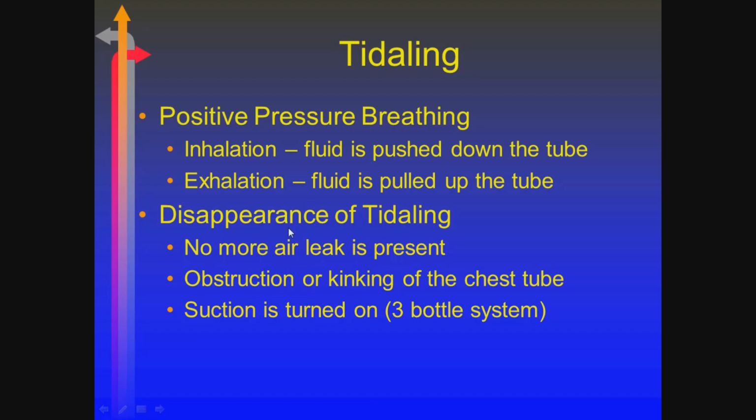With positive pressure, it's the opposite. So on inspiration with positive pressure in the intrathorax, you're going to end up seeing fluid move down the tube. On exhalation, it returns back up again. When we don't see any tidaling present, that's an indication that their air leak has been resolved or that there's an obstruction in the system.